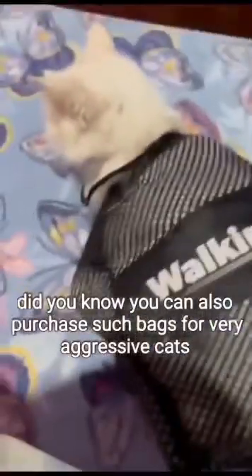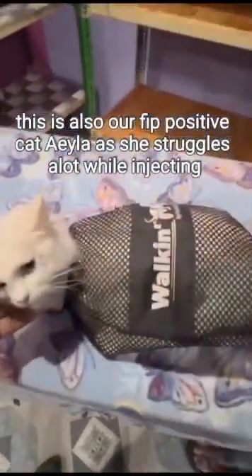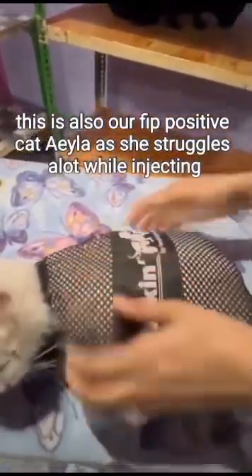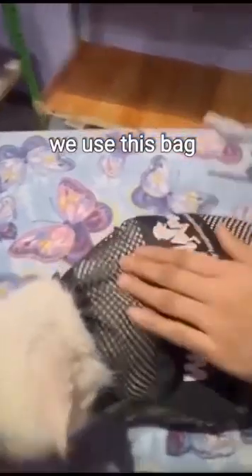Did you know you can also purchase such bags for very aggressive cats? This is our FIP-positive cat Ayla, as she struggles a lot while injecting. We are using this bag.